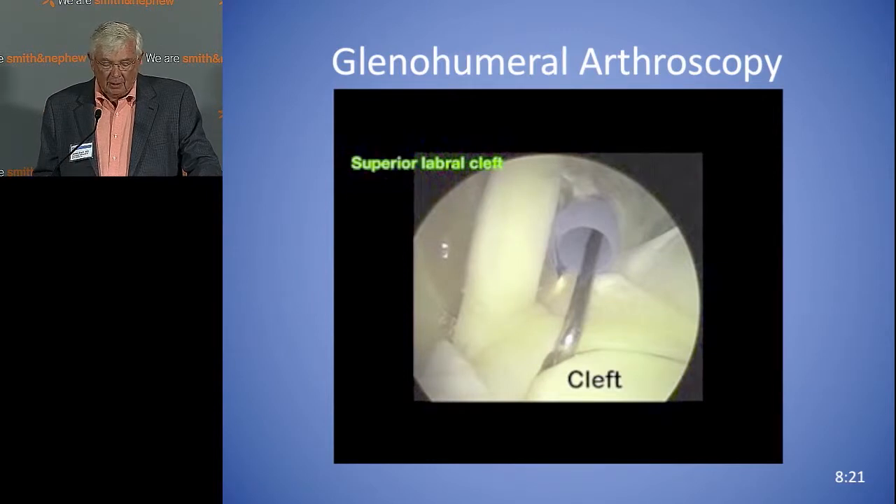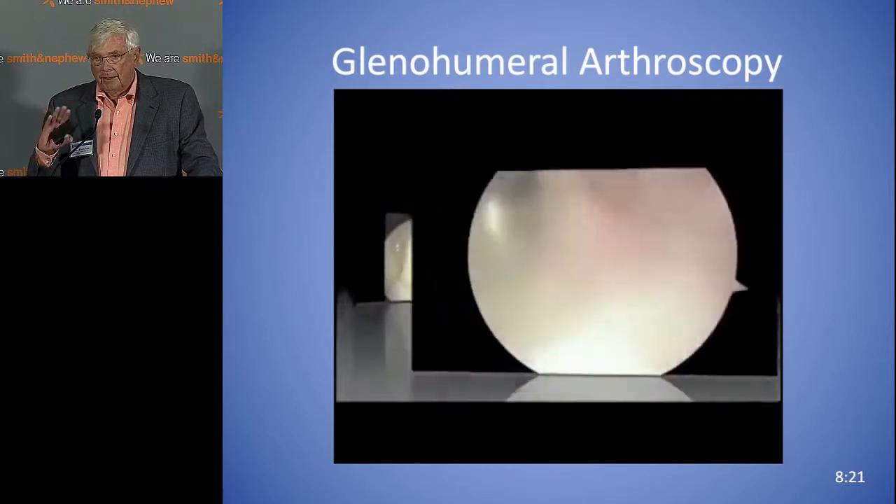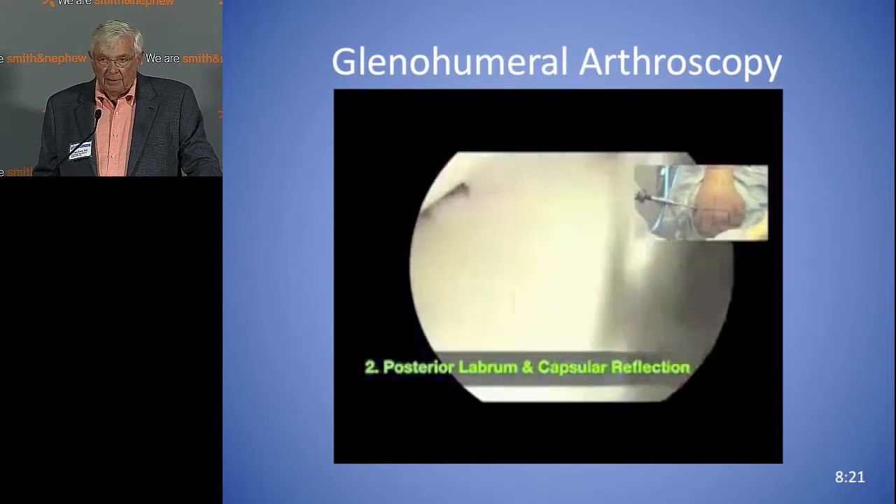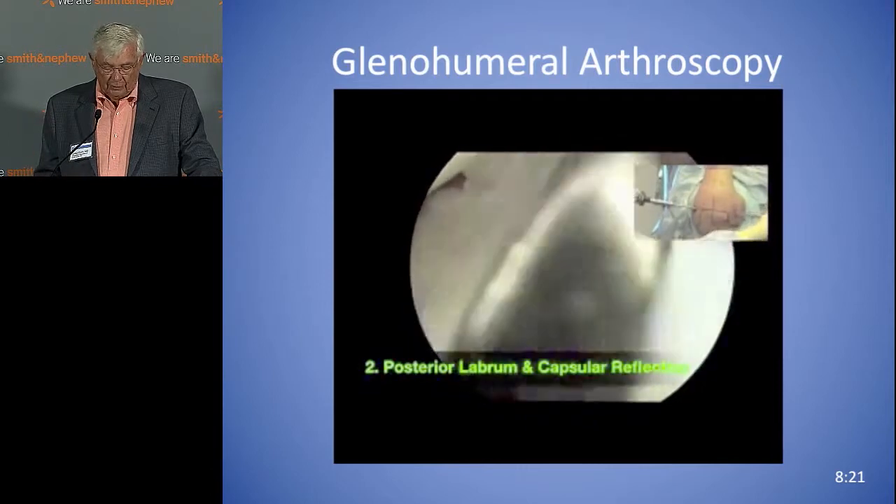There's also a cleft superiorly, and that's not a SLAP lesion. Dr. Ditrasek did a study years ago showing that about 60% of people have a loose superior labrum.